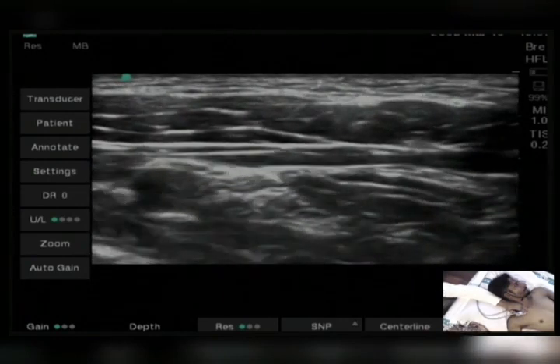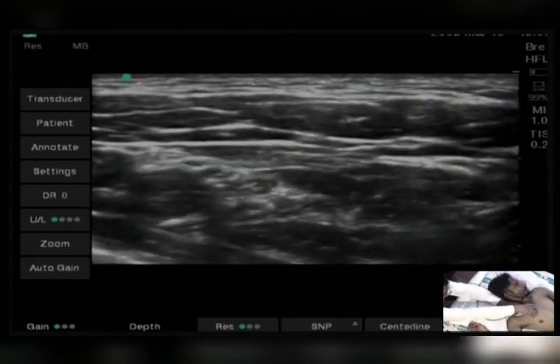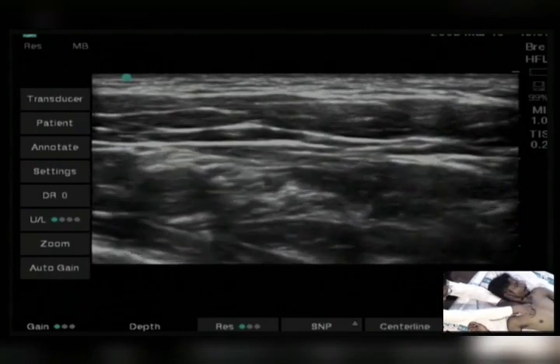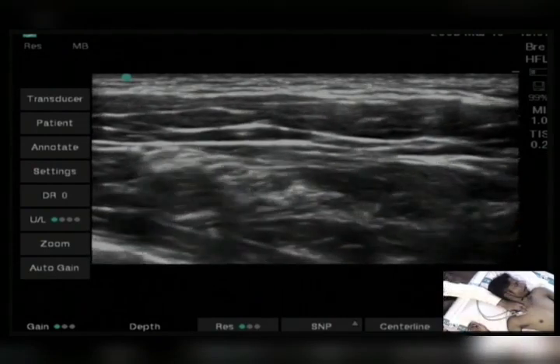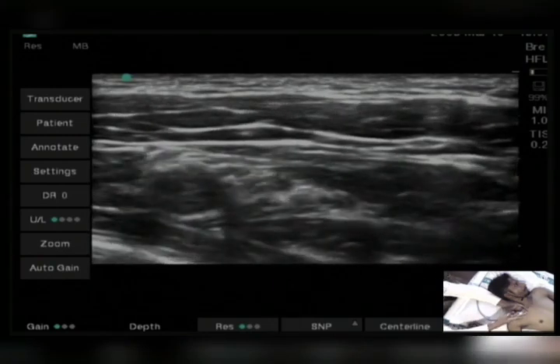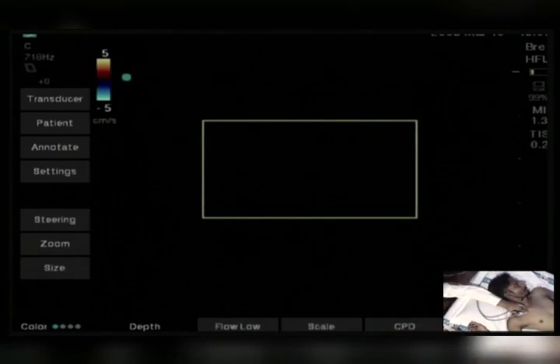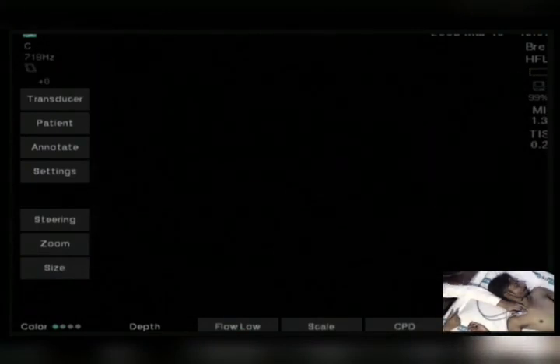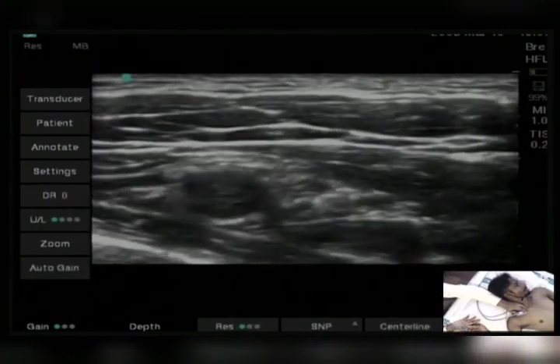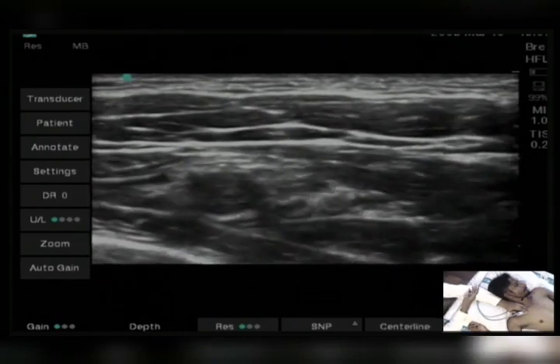For the medial approach, I will stand on the opposite side and I will enter the needle from medial to lateral. Okay? Which one is better, that I don't know. Initially I started with this approach and ended with the medial approach. So I can't say which is better. It depends on where the machine is going. Okay?